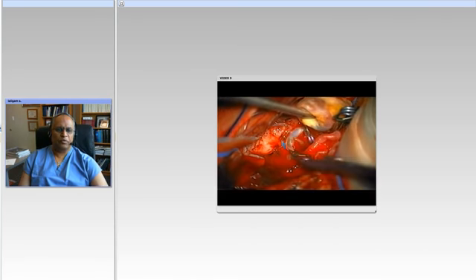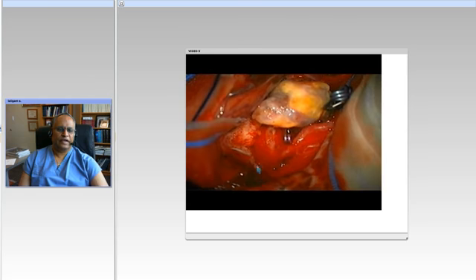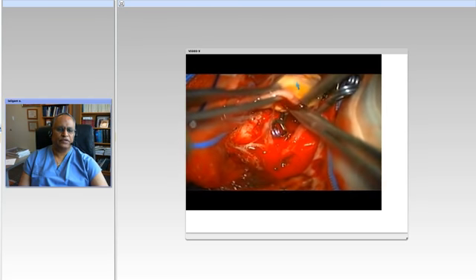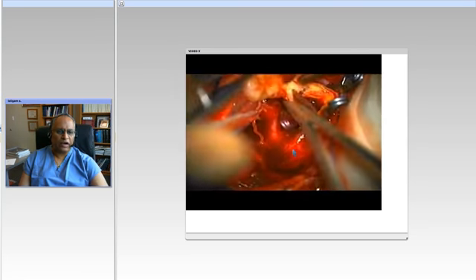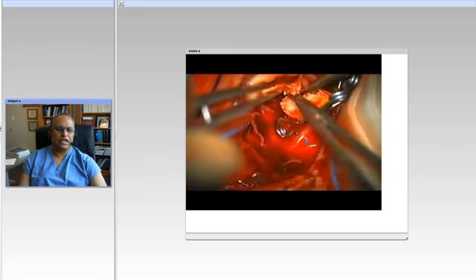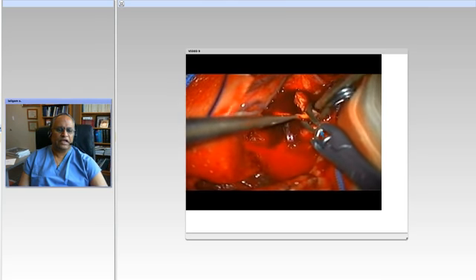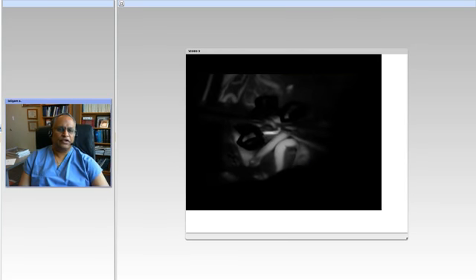So I'm just going to put temporary clips now on the two M2s, and the aneurysm is completely trapped. And there's a small branch that is bleeding. So we're going to excise the aneurysm, very sclerotic. And here you can see the inlet and the outlet in a minute. And so that's the inlet, still a little bit of bleeding despite a proximal temporary clip, meaning that it's not enough to close it down. I'm just closing it, and ICG angiogram afterwards.